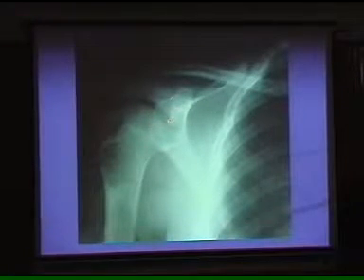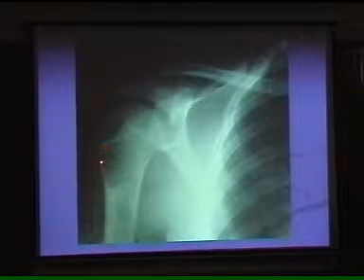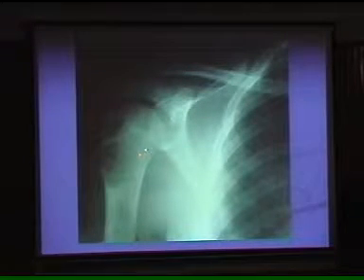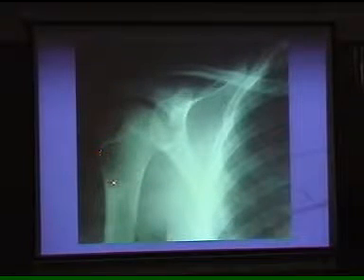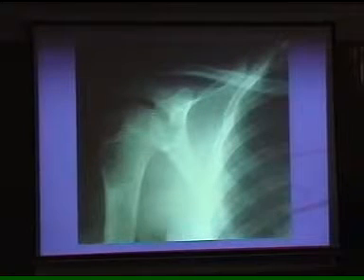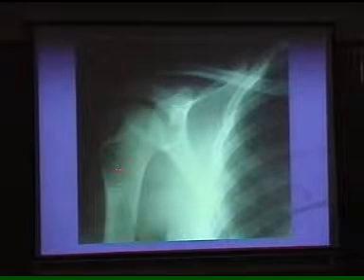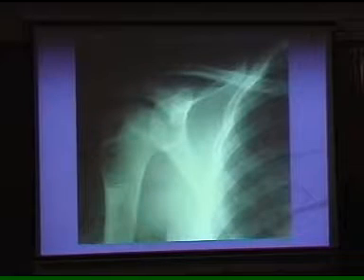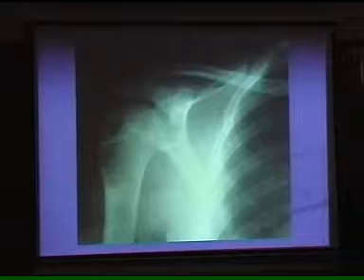Look at the glenoid cavity, that is well preserved. The clavicle is okay, there is no fracture. But the positive finding is a very well defined, smooth outline without a break of the cortex on this X-ray. Now let me show you how multiple modalities are helpful. On simple X-ray, you don't find any fracture. There is a well-defined lucent area in the upper end of the humerus, and a little density over here, but the cortex appears well preserved. So that was the incidental finding when the boy complained. We diagnosed a simple bone cyst.